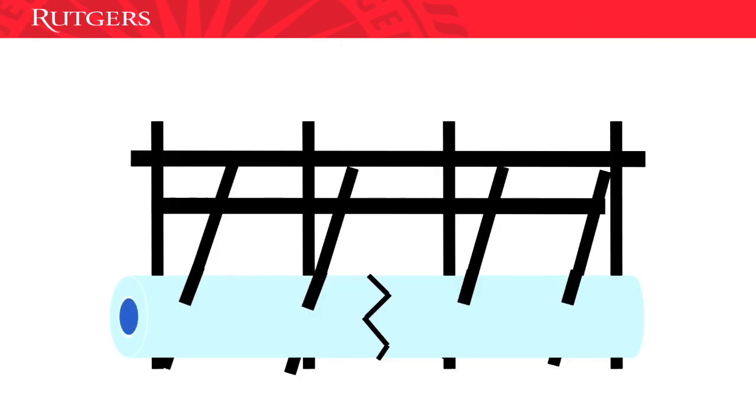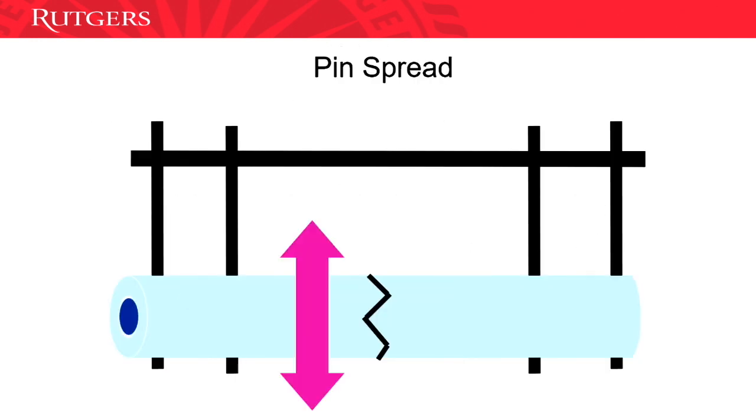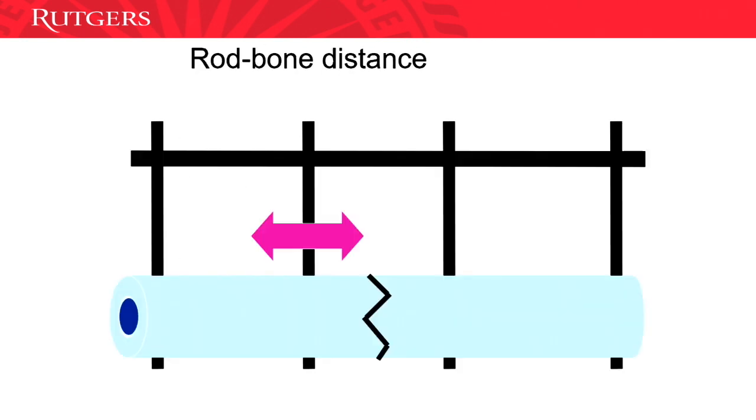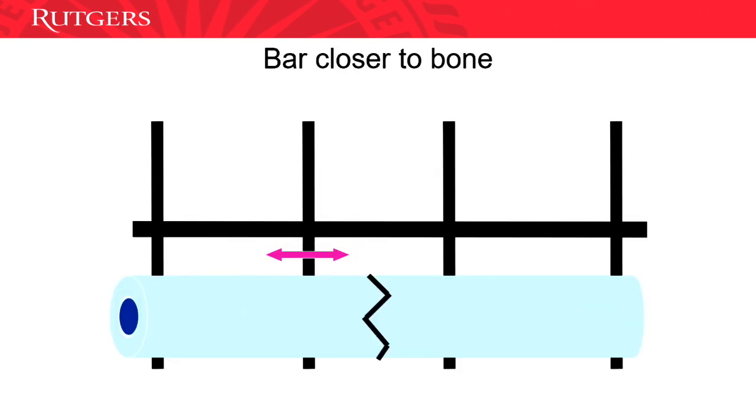You can double stack it for getting more stiffness. You can have it in multi-planes. Pin spread, it's better if it's closer to the fracture site, but that's where you usually end up making your incision, where you might put your final plate. And then moving the bar closer, I thought this was a thing.